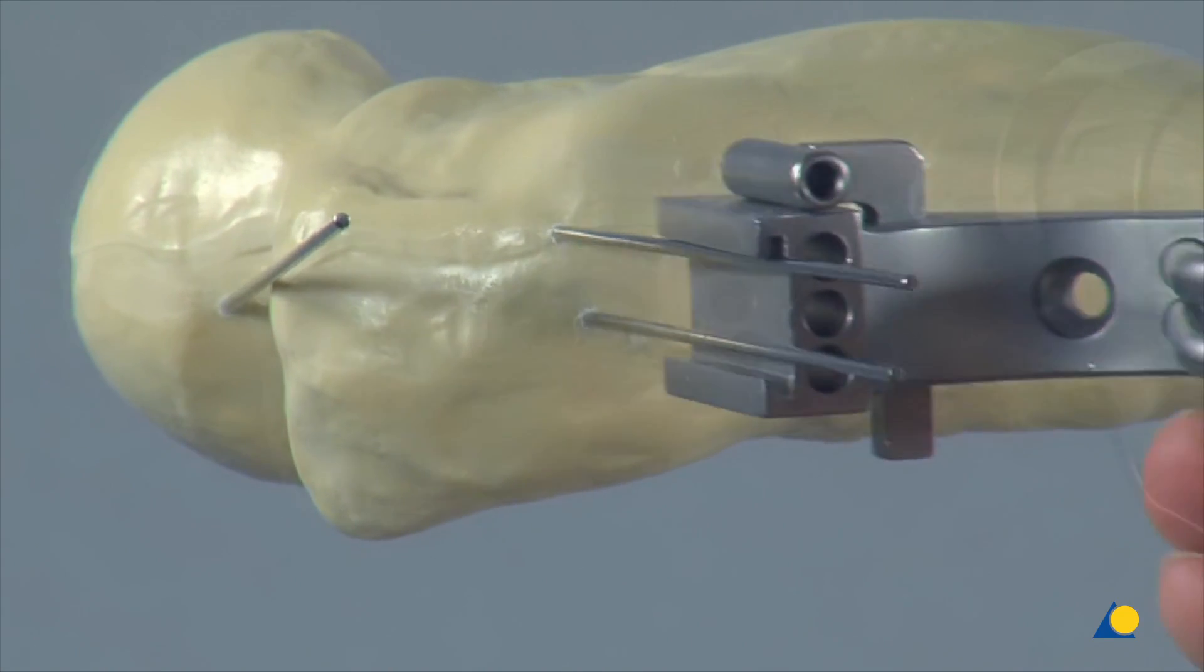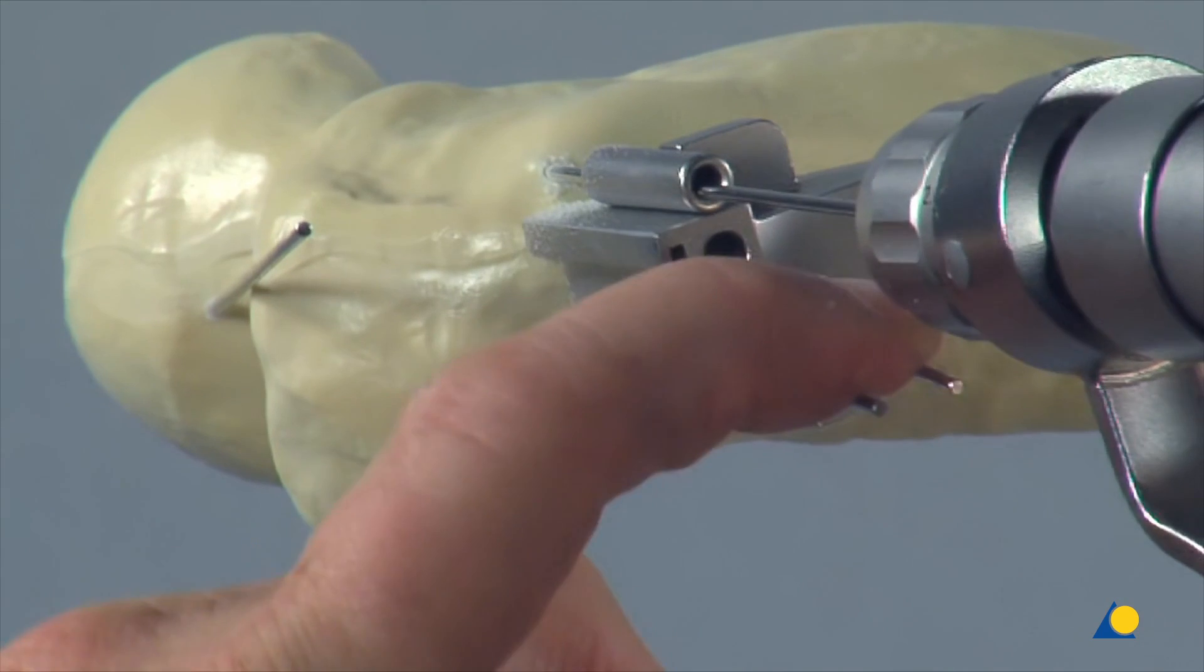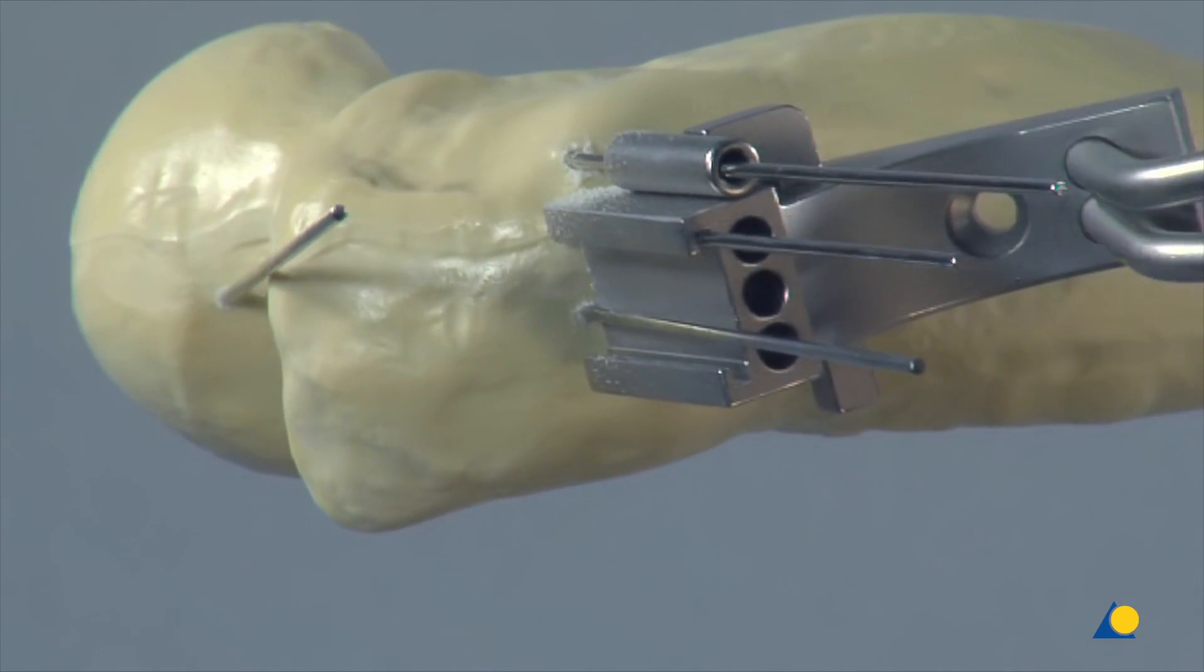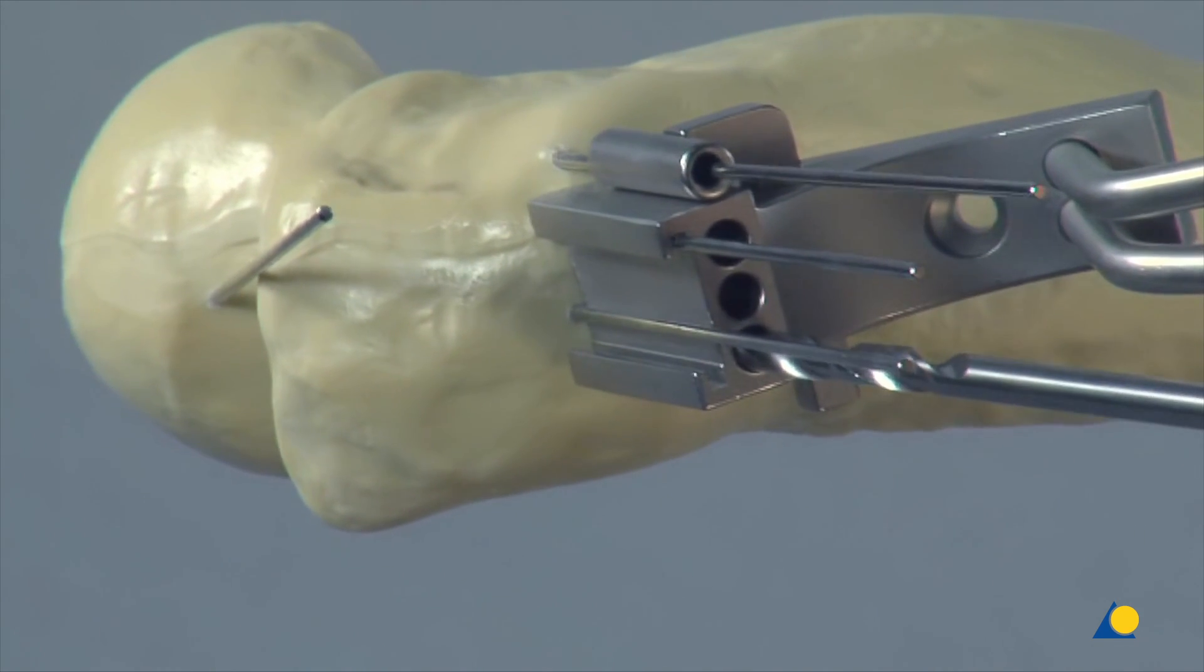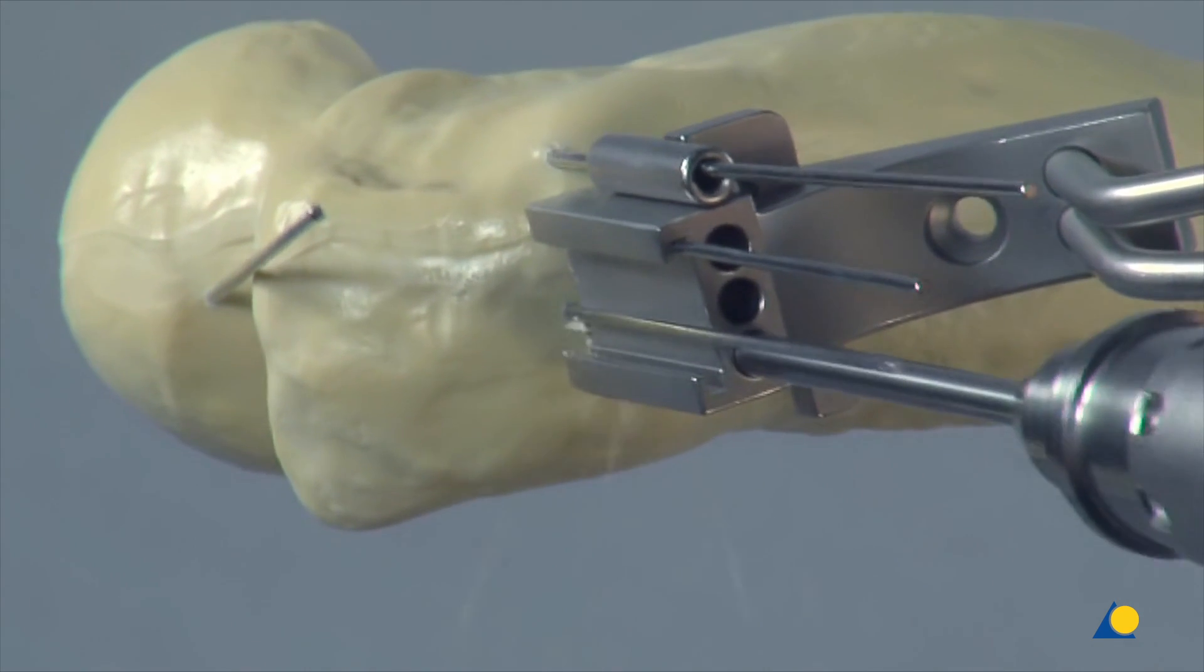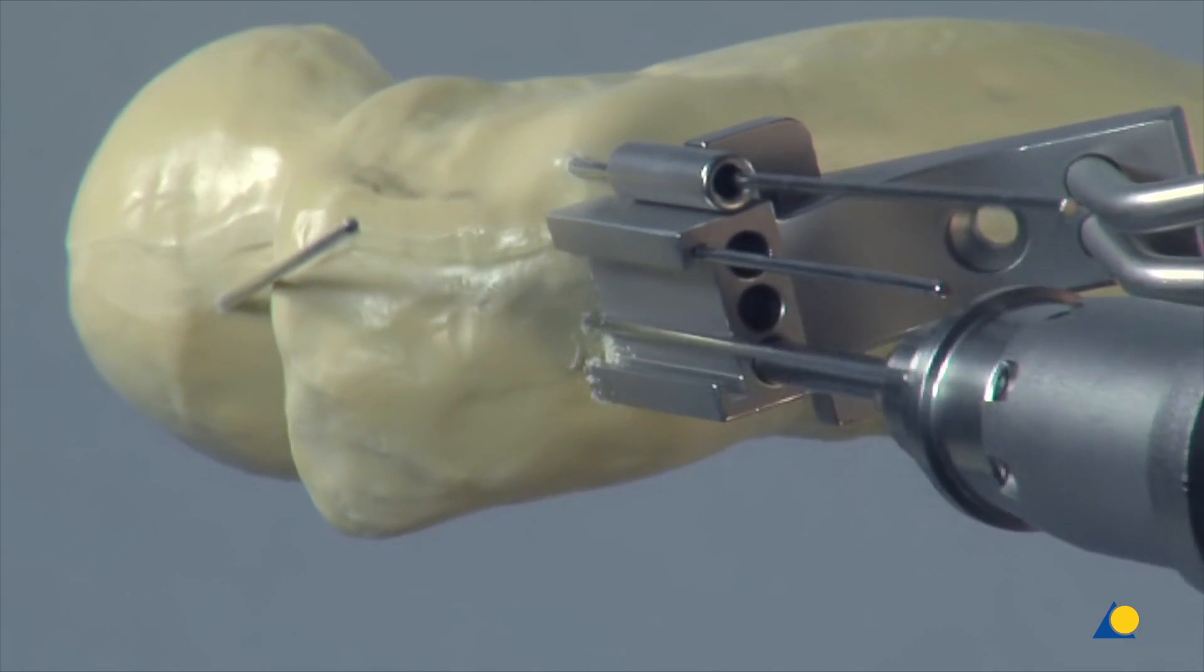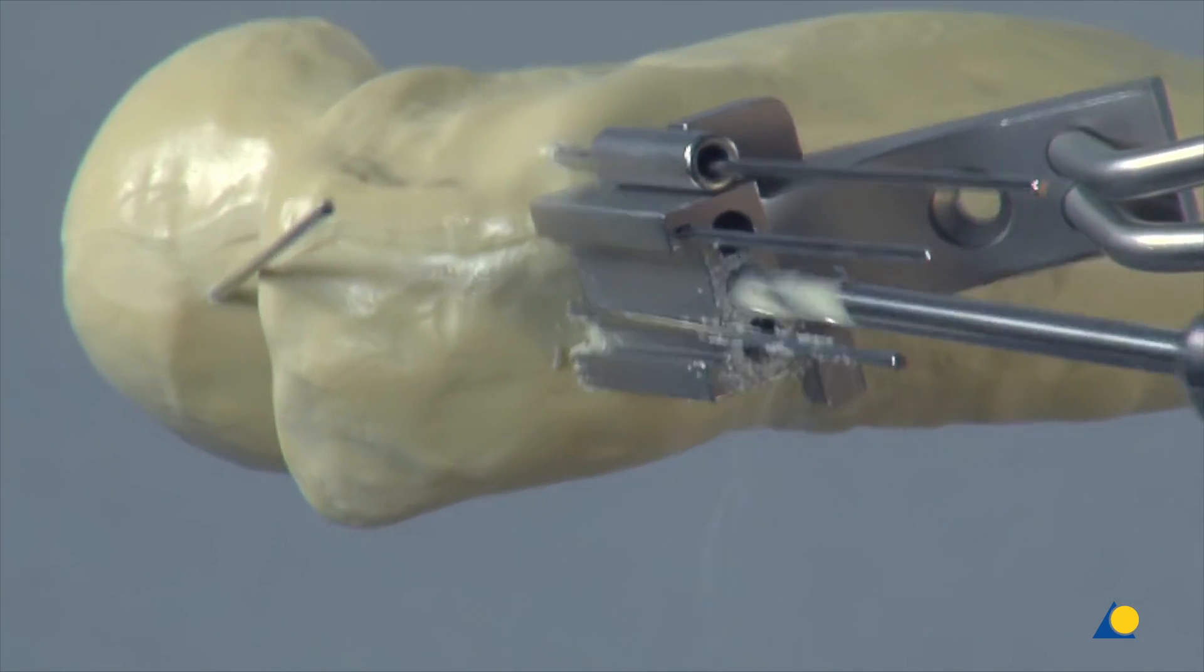The 130 degree triple drill guide is slid down the second and third K-wires and secured with an additional K-wire. The lateral cortex is perforated with a 4.5 millimetre drill bit to a depth of 60 millimetres. Be careful not to penetrate the femoral neck.